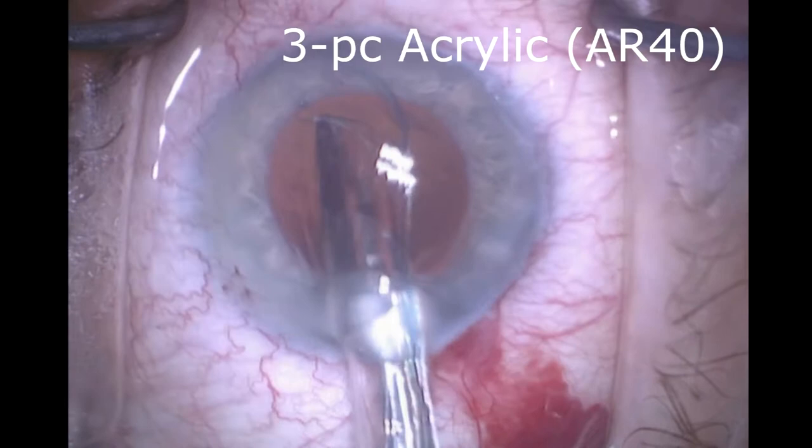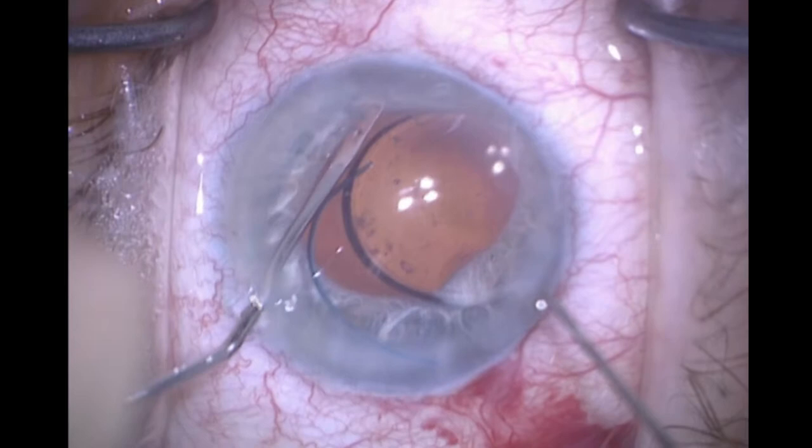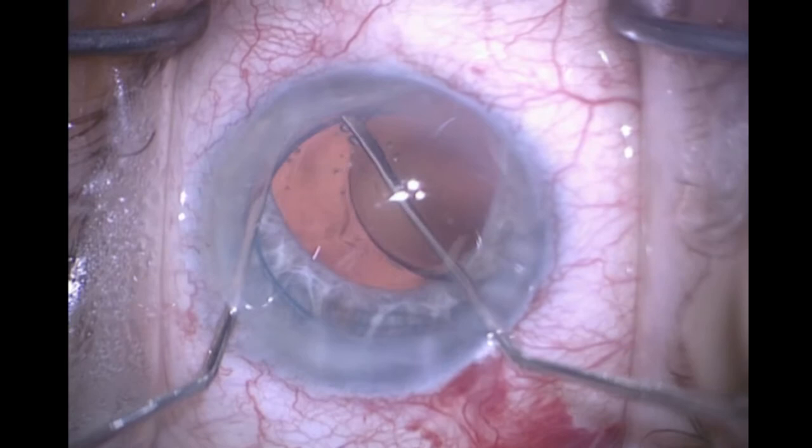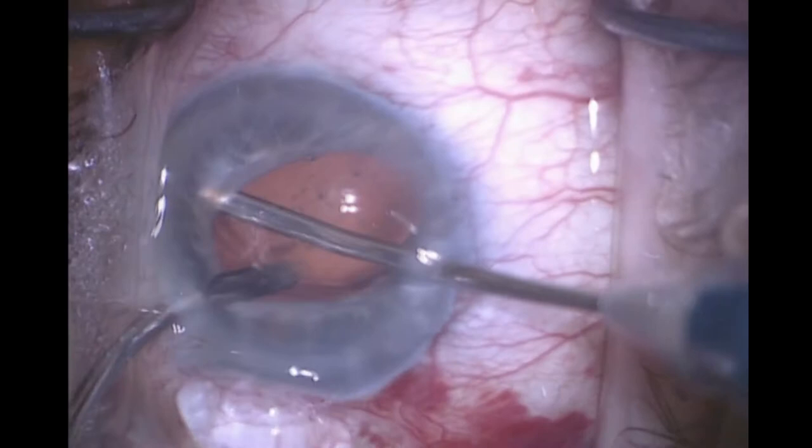This happens to be the J&J Sensar. As this opens, I will carefully place each haptic under the iris so that it does not go into the capsular bag. This will ultimately be oriented in the horizontal meridian and will give me two-point fixation of the haptic against the ciliary body, in addition to just the zonules.